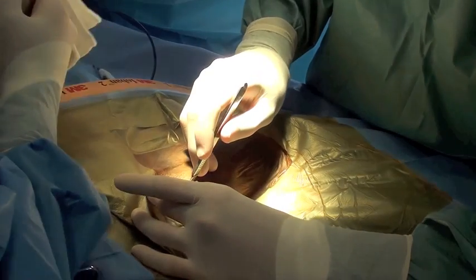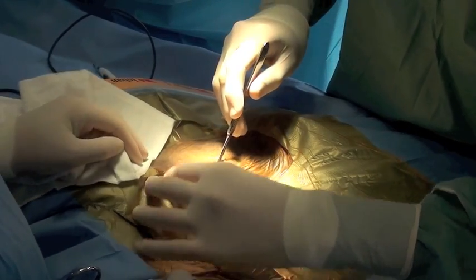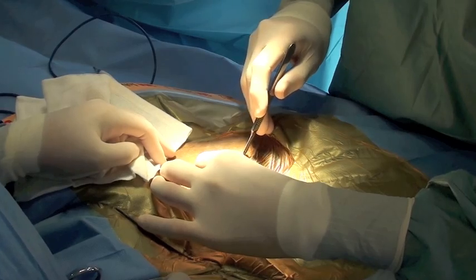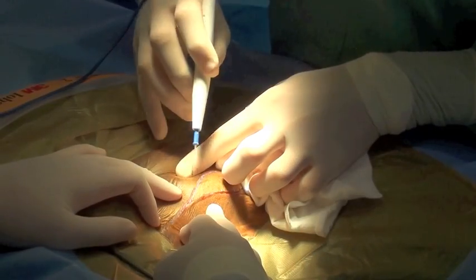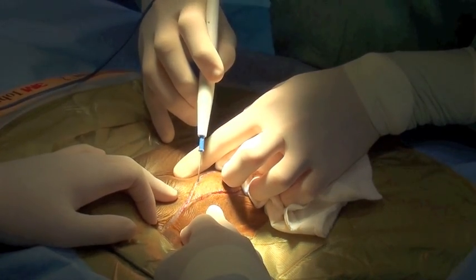The initial skin incision is made, centered over the proximal humerus. Great care is taken to include the previous biopsy tract to prevent tumor seeding.